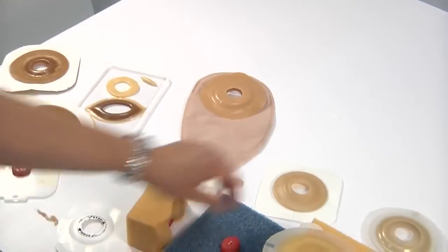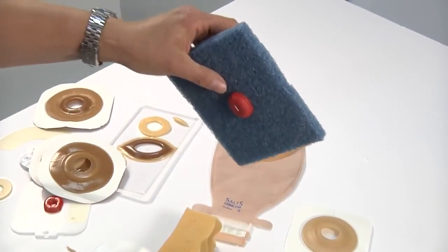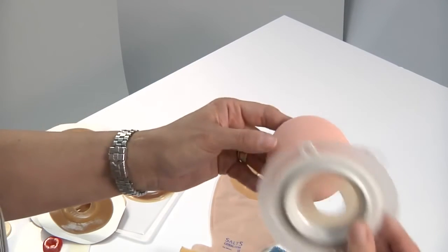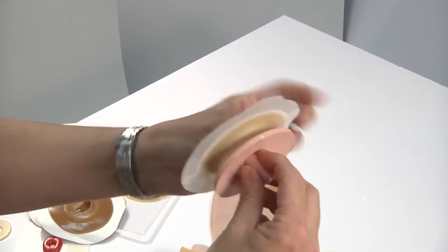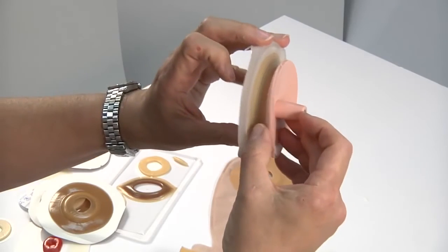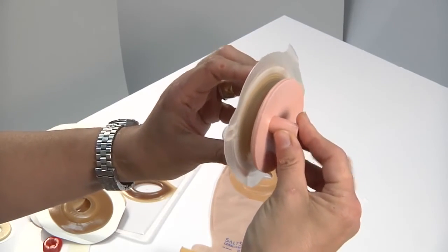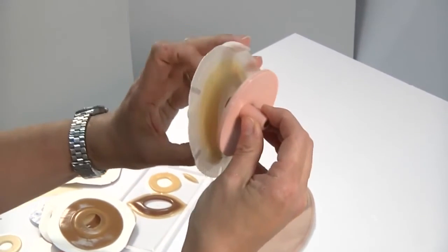And again, I just want to show you some of the things to be aware of. If you have somebody who has a flush stoma like this and you're thinking they need a little bit of convexity because of leaks, be careful of the depth that you choose, because as soon as you push onto it, you have to realize that a very firm belly may actually want to push that away and push the barrier off. When you have that gap here, that's going to be less of a place for it to adhere and hold on to the surrounding peristomal planes. So you may be better in a situation like that to try a lower level of convexity.